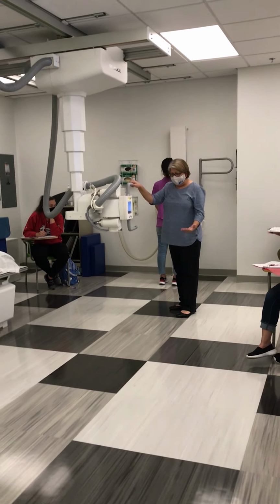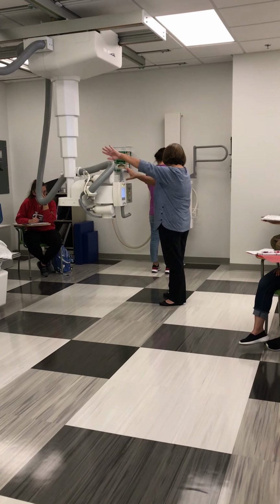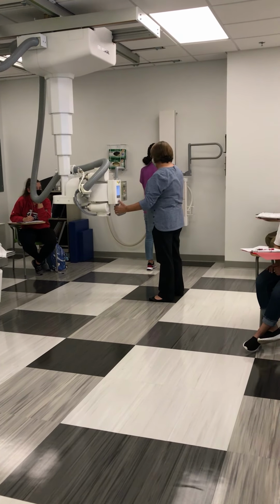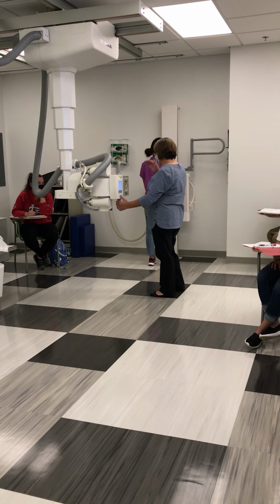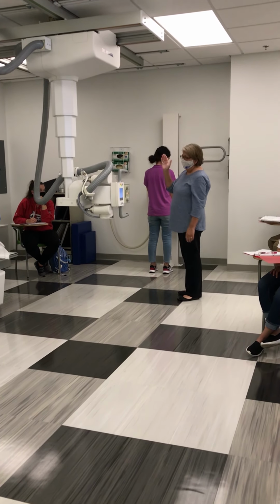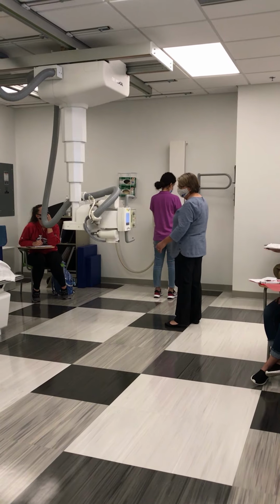Also, last week I told you that when you're working at the table, there is no detent longitudinally. At the wall stand, I'm going to put my tube in detent to lock the tube in at a specific distance from the tube to the image receptor.